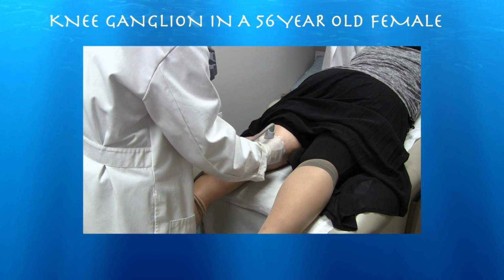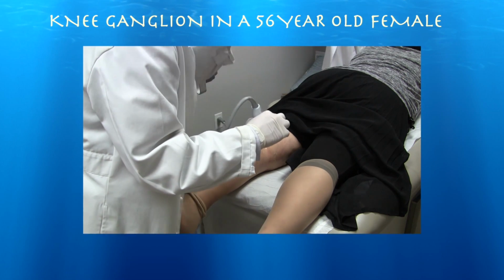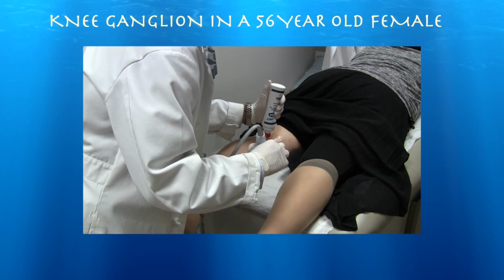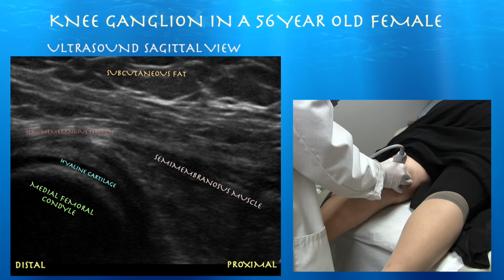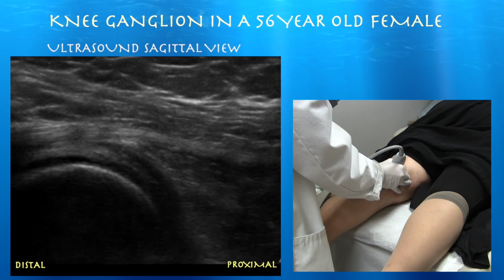Now, she's got a nice little crease here, which probably causes some anisotropy and artifact. So I'm going to try to be a little more generous on my gel. And you have the semimembranosus muscle on the bottom of the screen. And here we can appreciate the semimembranosus muscle transitioning to a fairly thick tendon right above the medial femoral condyle. And now I'm just going to go distal.